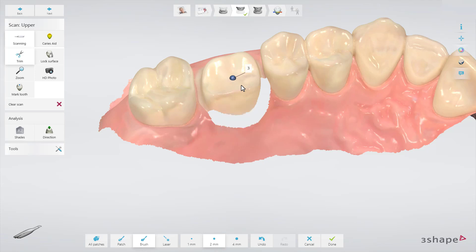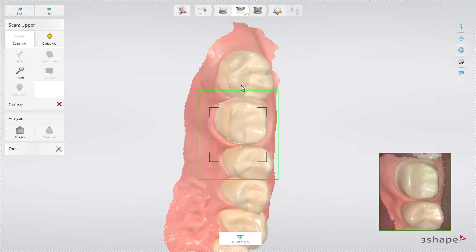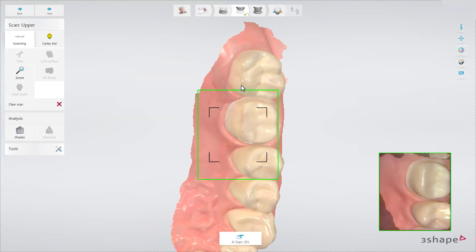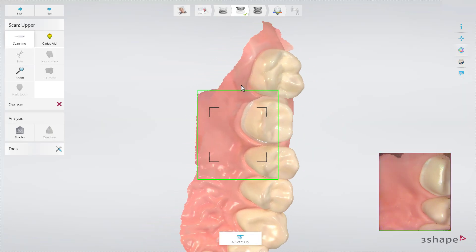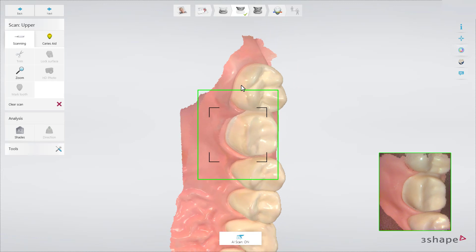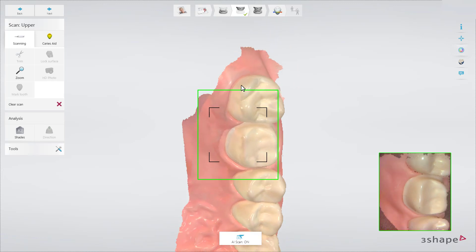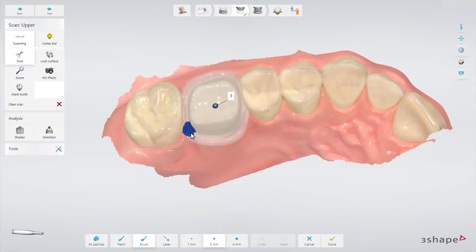Adjust in mouth and re-scan the area. If you trim a locked area, the area is no longer locked and will need re-scanning.